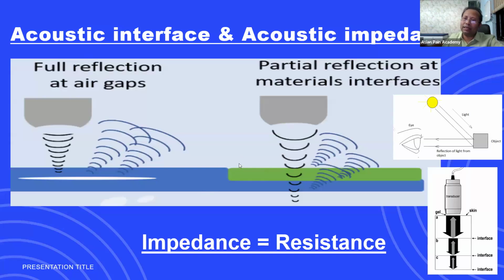Reflection, as I told you: say 100, I give a simple marking to the incident ultrasound wave which has come from the ultrasound probe. Say it is 100. So when it enters the next interface, the next layer, if 70 passes, then only 30 has the option to come back as a reflection, if I don't think about the other attenuation factors.